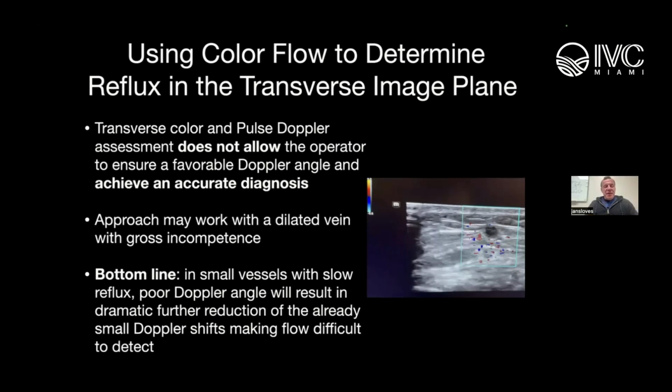If I'm just going to be completely honest, I don't even use it. I use the transverse view to measure the diameters. And that's it. Obviously, if I'm looking at a real C2 patient and I see that there's bulging varices, I mean, I know what I'm going to expect when I put the transducer down.